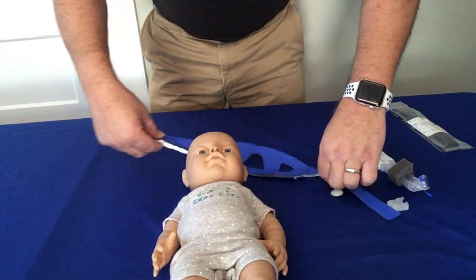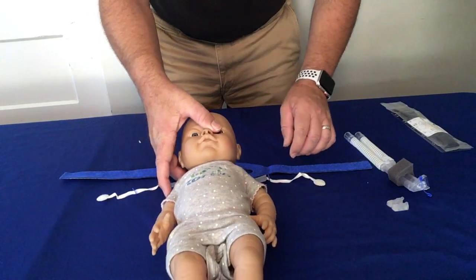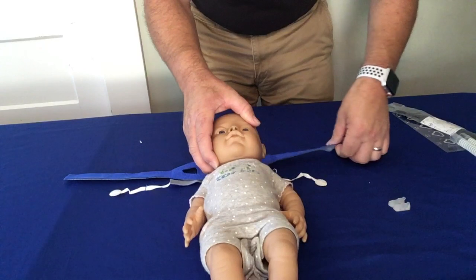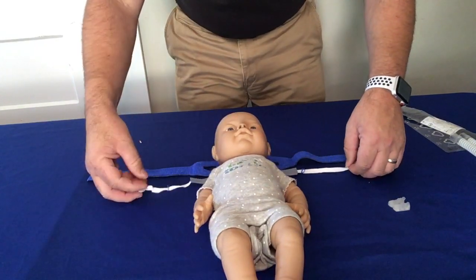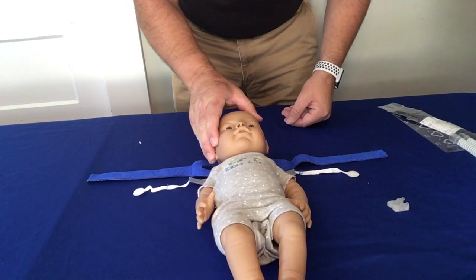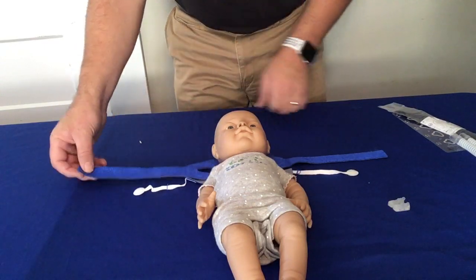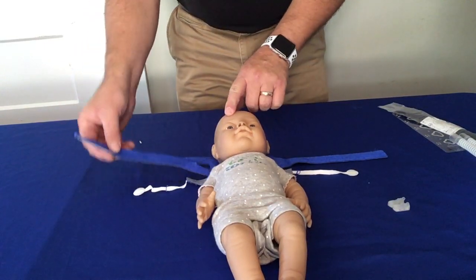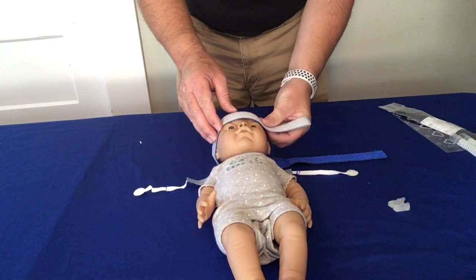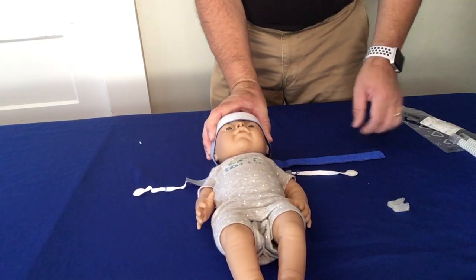So I've laid out my headgear behind the baby like this. And I'm now going to place the baby into it, let me go ahead and adjust it in front of this camera. Place the baby's occipital bone within the center of the headgear. Now, what you want to do first is pick up the Velcro that's going to be on your right-hand side if you're at the top of the baby's head and lay it across the eyebrows of the baby like this, securing it with your hand like so.